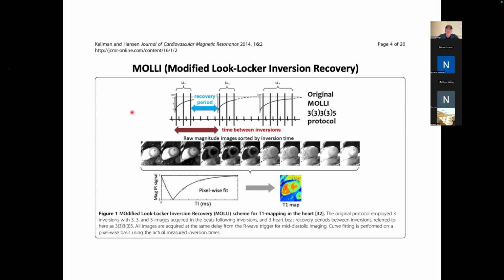Another method is called the look-locker inversion recovery method. And it gives a slightly larger dynamic range of values that we can fit for T1. But it's essentially how you model the signal that you acquire at each time in the QRS and the delays between acquisitions such that the whole tissue has the ability to recover to a new part of the T1 recovery curve.